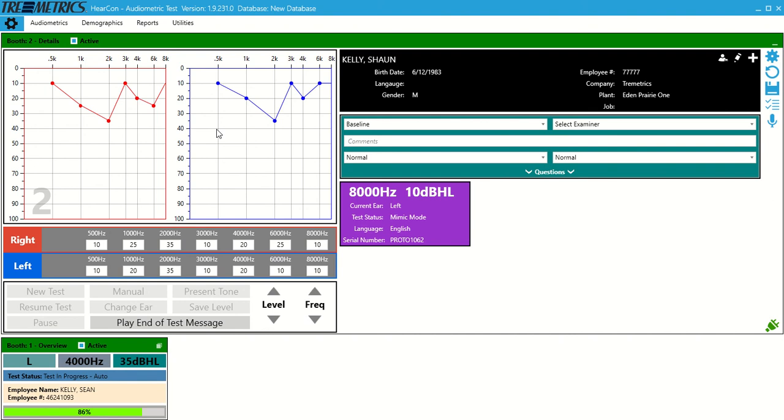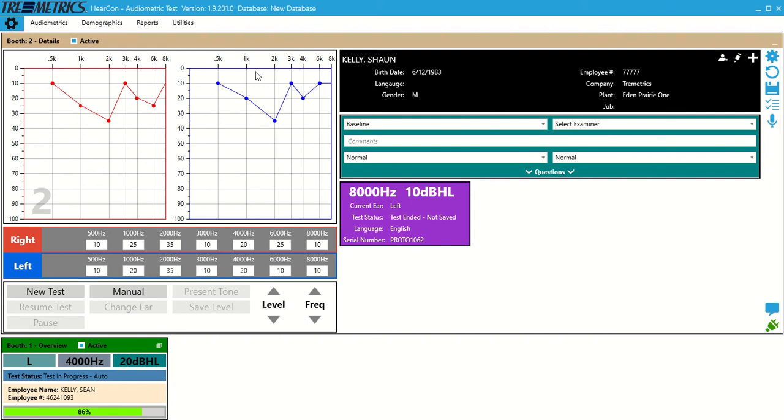We can also more or less sidestep it. Let's say if we want to end the test now, we can play end a test message. And now it's telling the guy in the booth in booth two, test is complete, take off the headset, all that, even though booth one is still going. You can set it so nobody can get out, but you can also override it if that situation comes up.